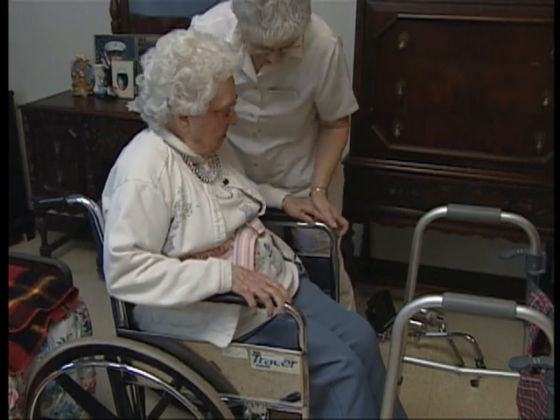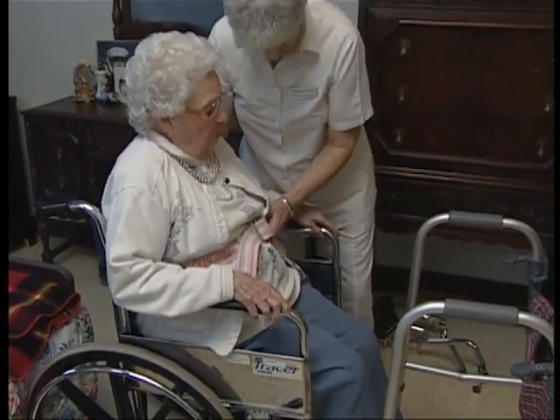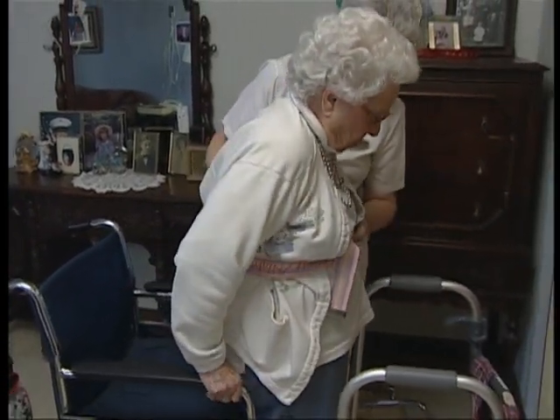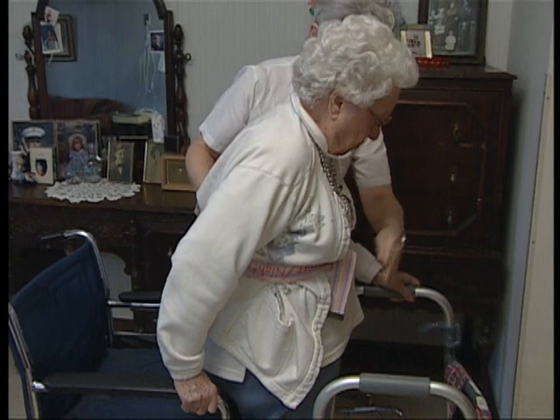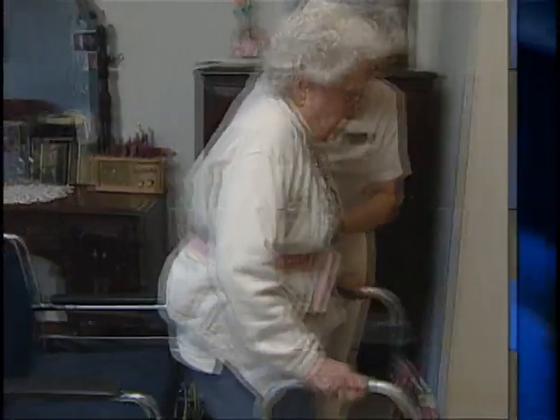Step 2. Securely grasp the belt around the sides. Instruct the resident to reach back and push up from the chair using his or her arms. Bring the resident to a standing position. Make sure the resident has a secure hold on the walker handle grips.